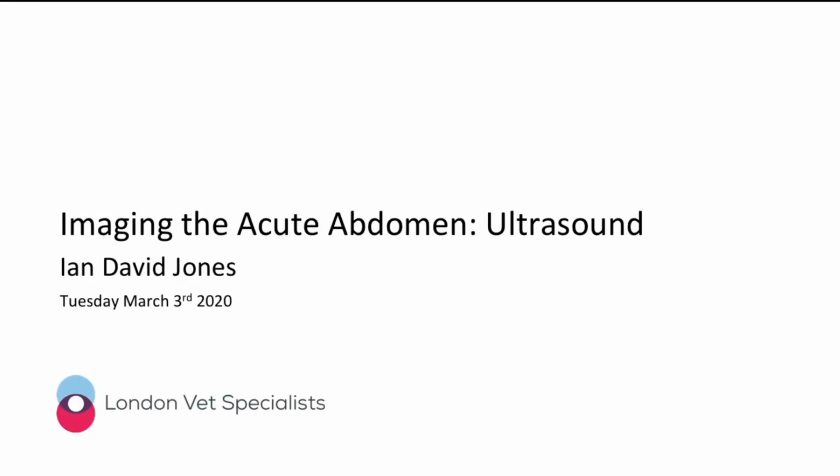Thank you very much for joining us for this CPD, where we're going to talk about imaging the acute abdomen using ultrasound.